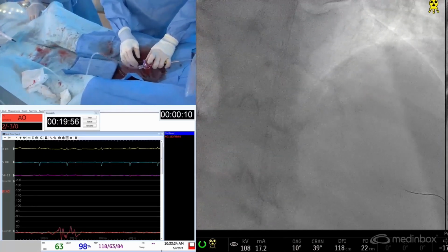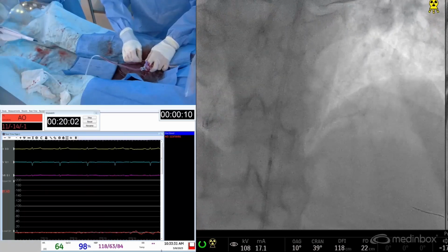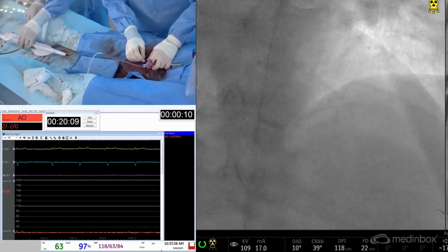We're two operators, so we might as well use the extra pair of hands. But usually when we do this alone, as Robert, I think, wanted to hint at, it is a one-man show where we can actually loop the wire distally.